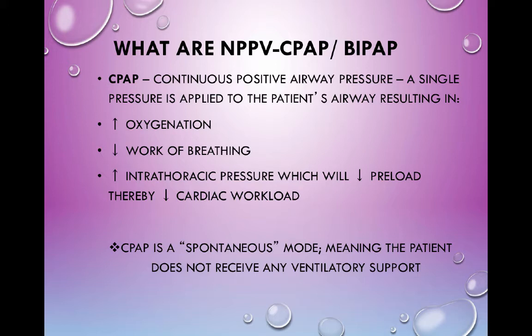So we'll put those patients on CPAP, and all it is kind of like our PEEP on a mechanical ventilator. We splint those alveoli open. Well, CPAP's going to splint open all the airways and keep the tongue out of the way and the soft palate and all those things. Keep the airway open so that they can breathe. That's all it is.